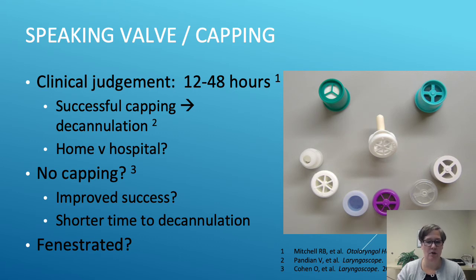in that patient. So just so that you know, if you really feel strongly that a fenestrated trach is what they need, you can actually special order one and move the fenestration anywhere along the shaft that you need it. The only downside to this is that customized trach tube now is a single cannula tube rather than double cannula.